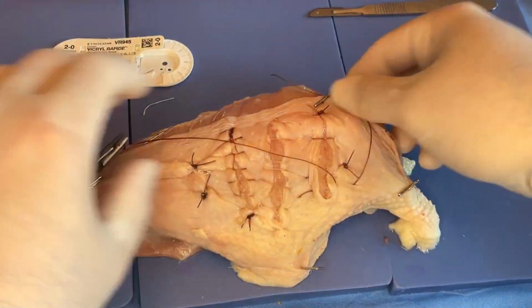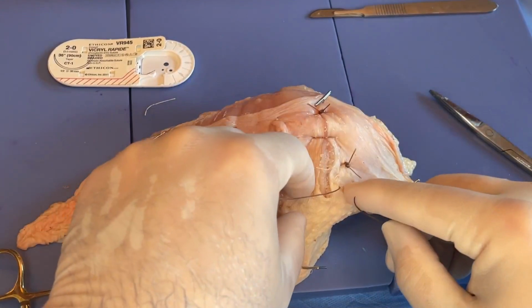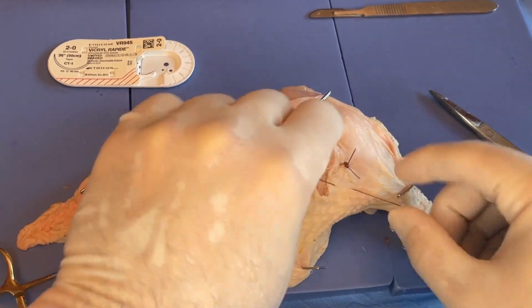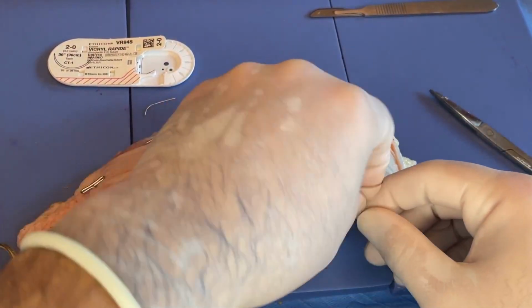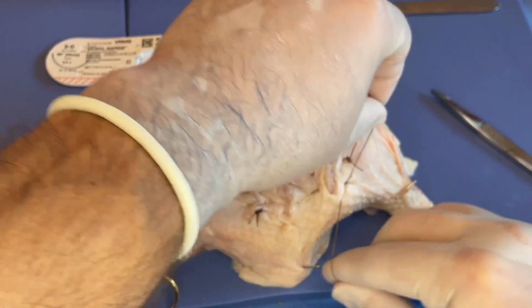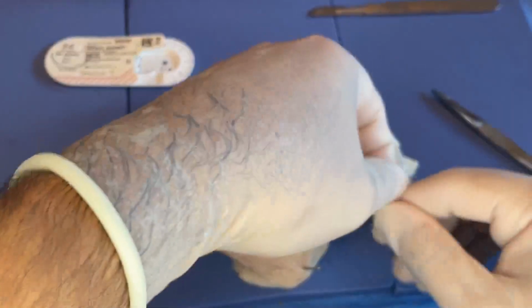Protect our needle there. And so again, you can see you're really taking big bites, the suture passing through this healthier tissue quite a bit removed from the defect itself. And as we tension that down, you can see how that really creates big compression deep down in there.